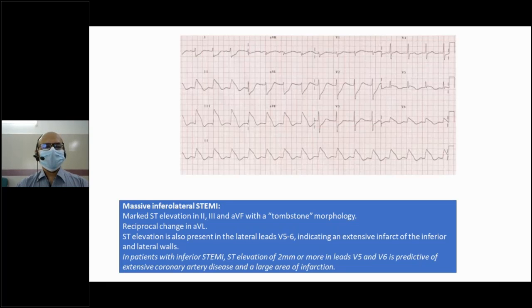First of all, when you see the ECG, always try to diagnose: is this myocardial infarction or myocardial ischemia? And then which territory is involved, anterior or inferior?